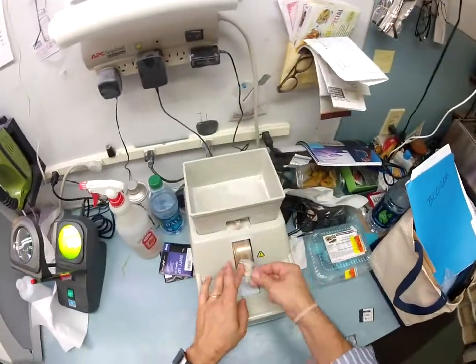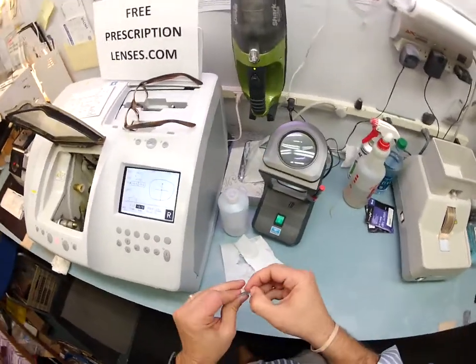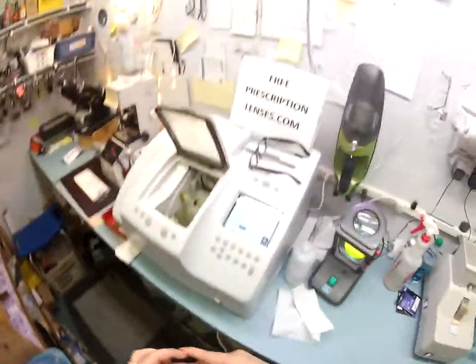So again, back to the handstone, which I should have dried this lens off first so it's not slippery. Tooting my own horn, and I almost set myself up for failure. So I'm just going to scrape that off directly over the floor this time.